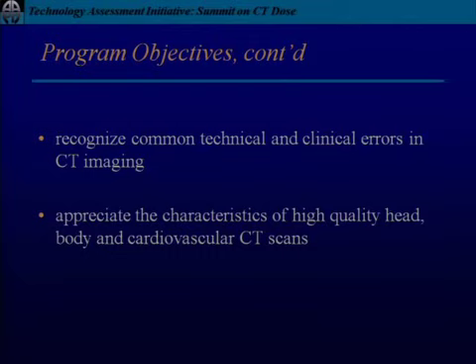The idea of cumulative dose to the lens has been known for some time, and clearly you do want to avoid the eyes, and the best way of avoiding the eyes is to tilt the head so that you're scanning from the skull base up, and the eyes are not there in the field at all. And that's not a helical versus axial imaging question. That is, are you willing to take the time to turn the patient's head and do a scout in a manner that you're avoiding the eyes?